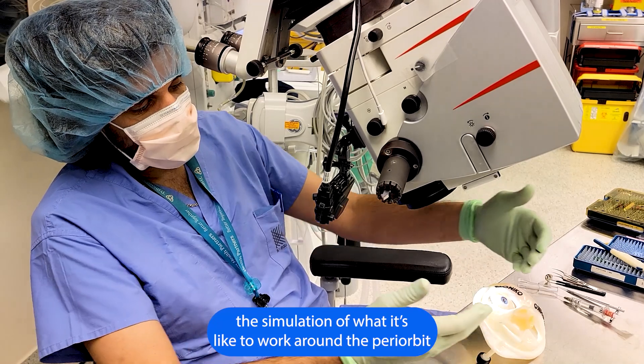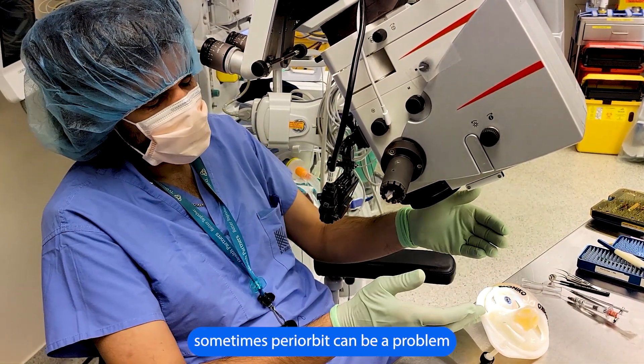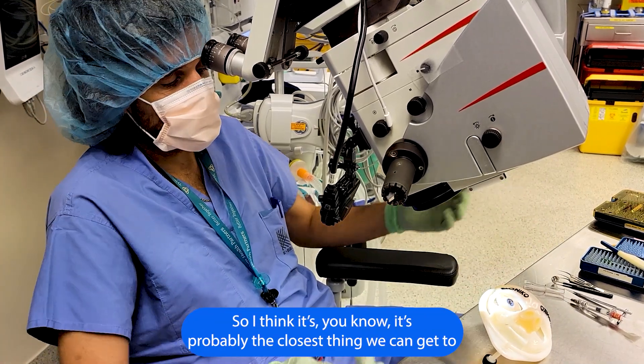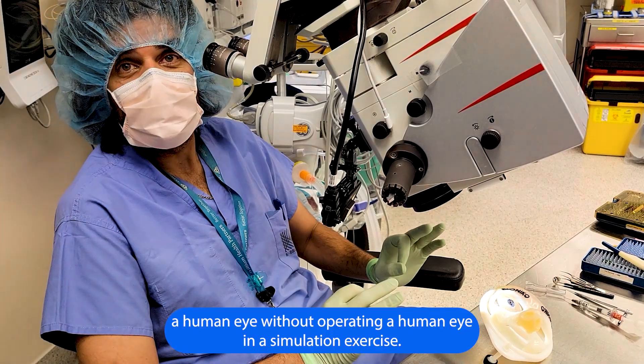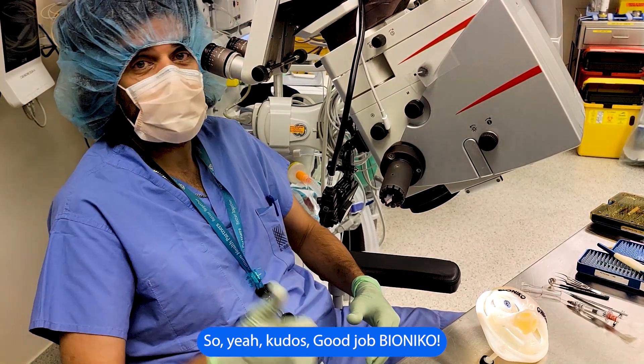The system gives us a simulation of what it's like to work around the periorbital. Sometimes periorbital anatomy can be a problem if you're not taking into account planning decisions and the right approach. I think it's probably the closest thing we can get to a human eye in a simulation exercise. Kudos, good job BIONIKO.